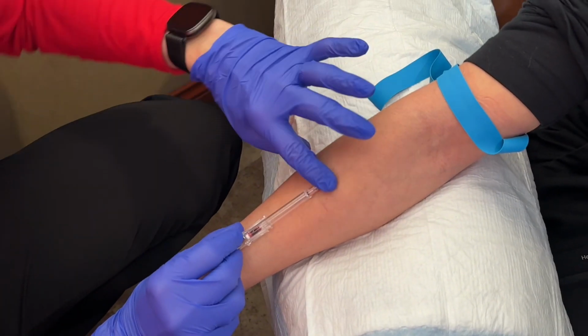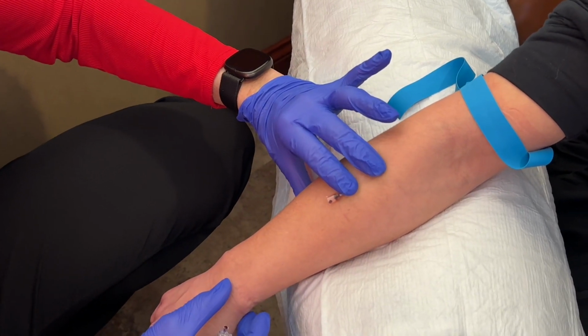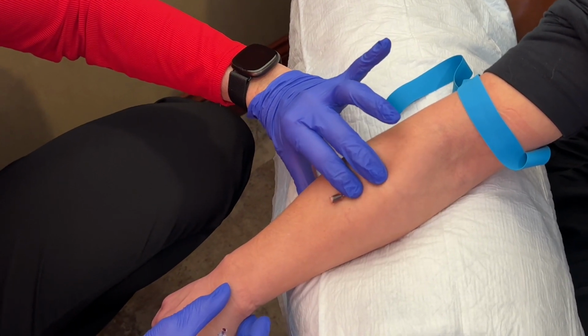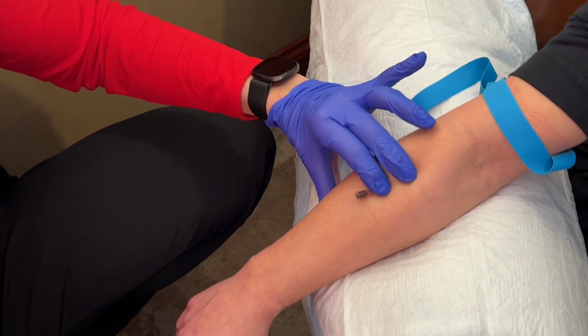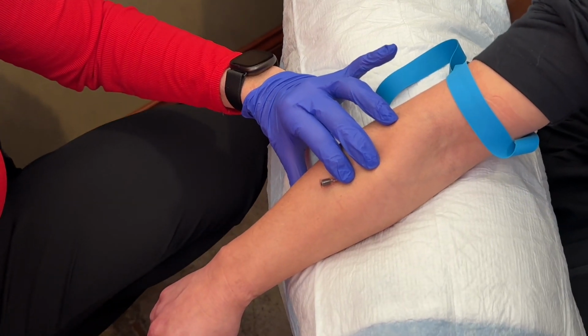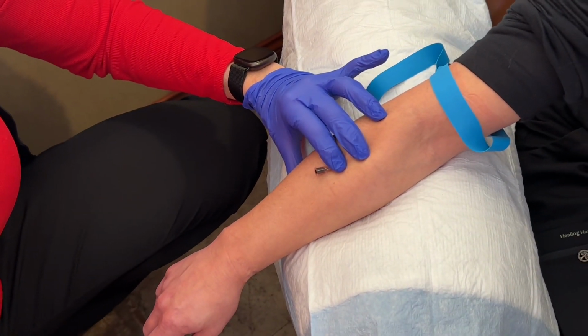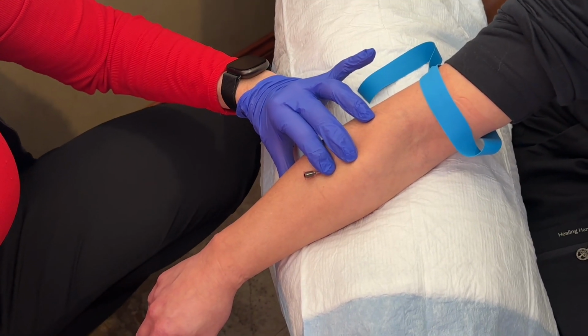Obviously, we've got a great blood return. I did not bring down a flush, but if you let go, you're going to see all your blood coming out. You know you're in that vein. Did you feel that at all? Did not. Zero. And the injection of the lidocaine, I barely felt. Barely. Hence why I have used lidocaine for 30 years.